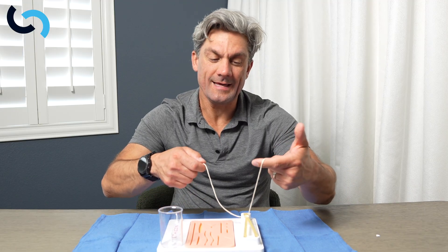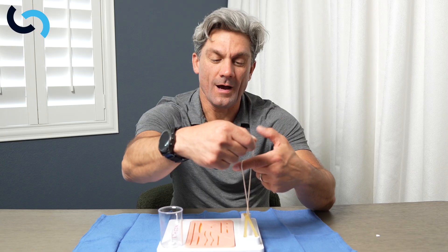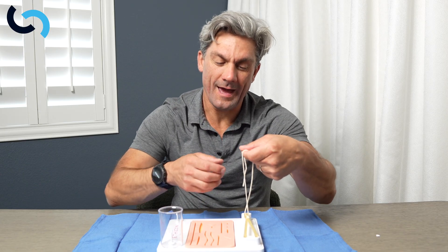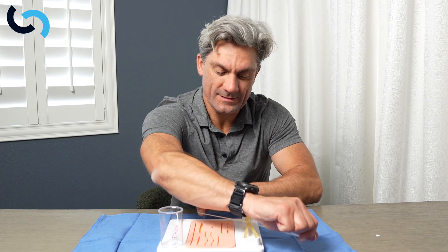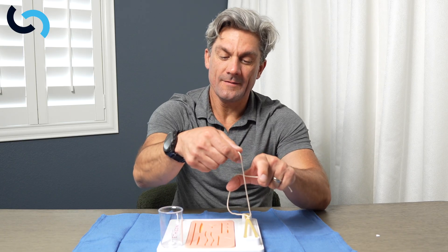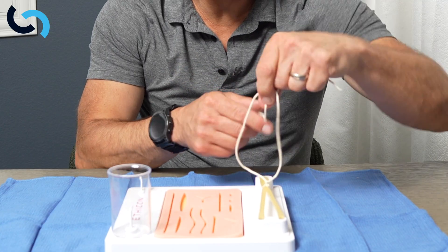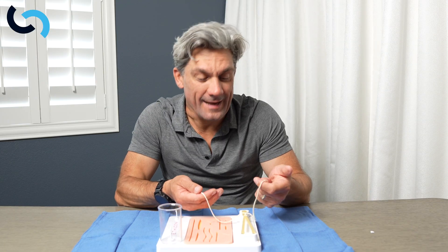The next one is the index. Come through with the index finger, cross with your hand, thumb through, index on, back through — and again, we're putting that down nice and square. Finally, we come over our thumb, index through, thumb on top, push the thumb through the loop, and we're coming back down square.